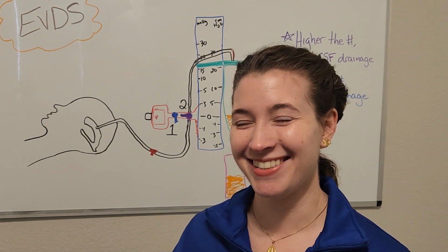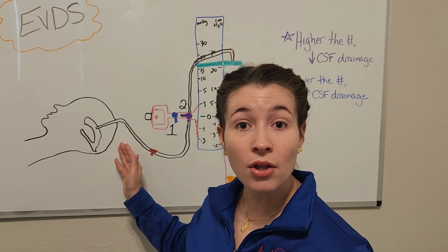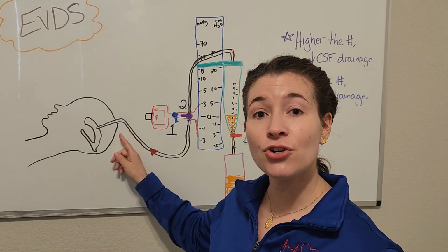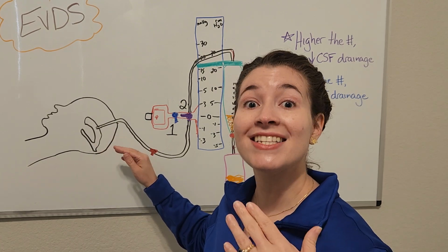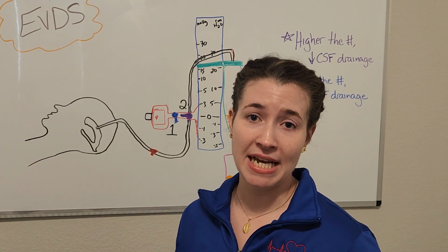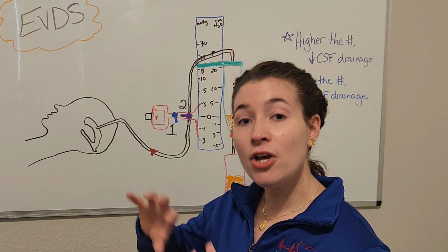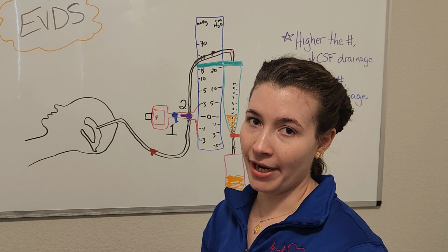Not good. So typically what happens is the neurosurgeon is going to drill a hole in the cranium of the patient and then insert a catheter into the lateral ventricle of the brain. It's the ventricles that are responsible for the production of CSF. So this is how we're going to be able to access the CSF, drain it off of the patient, and then lower the pressure in the brain.